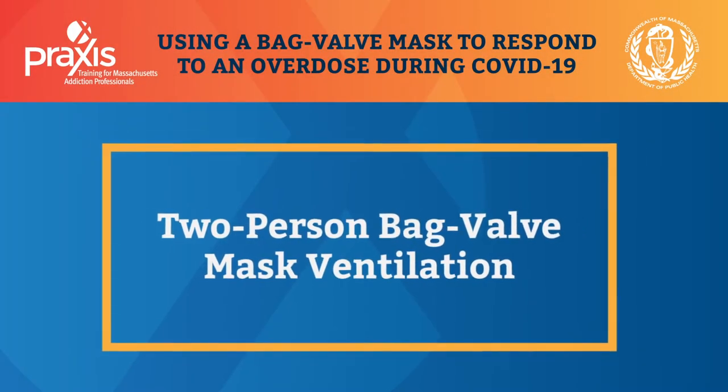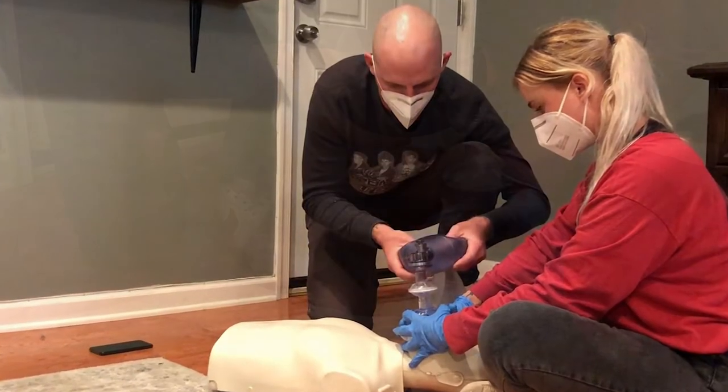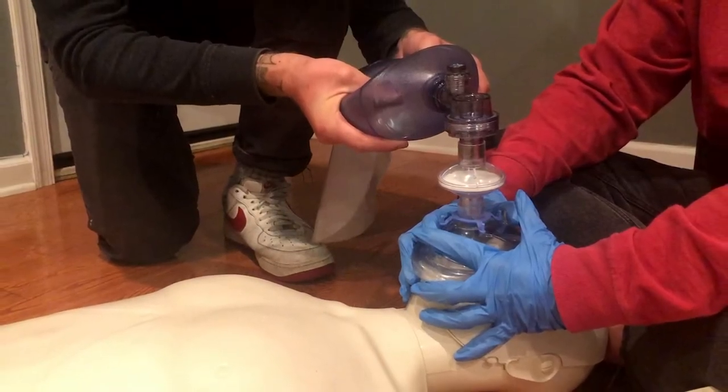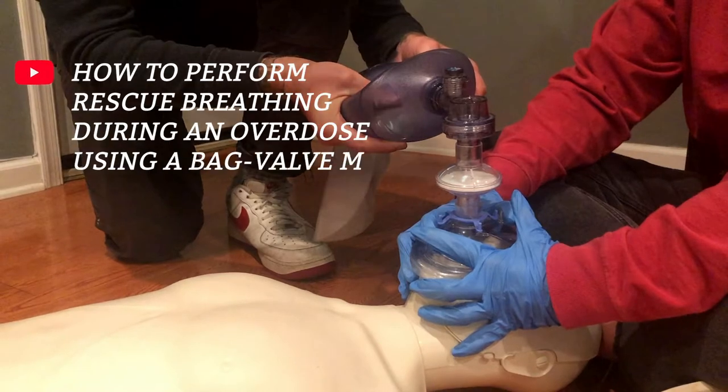Two-person bag valve mask ventilation is easier and more effective than one because it helps to have two hands on the mask so you can keep a tight seal. This video covers how best to share the work between two people responding to an overdose. For complete instructions, watch the video in this series: how to perform rescue breathing during an overdose using a bag valve mask.